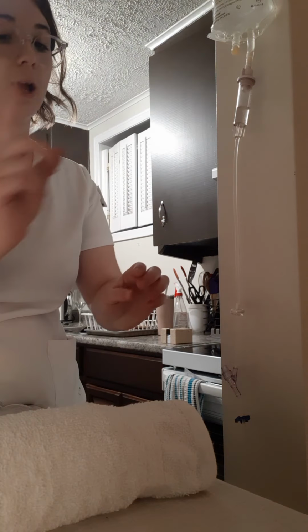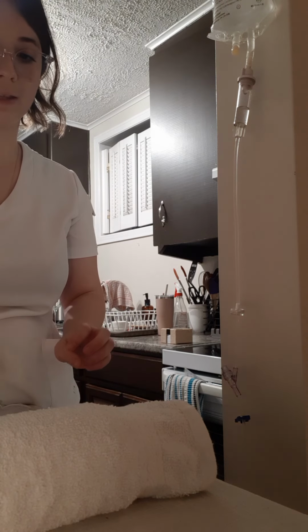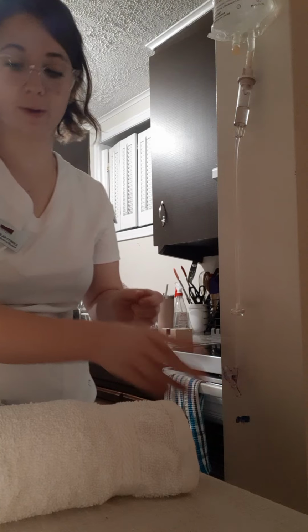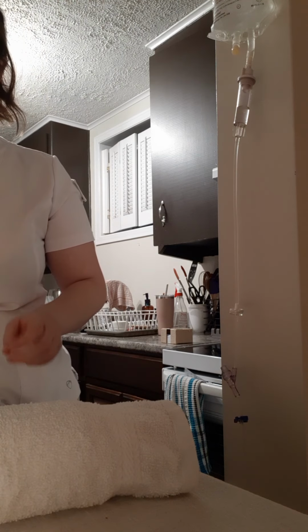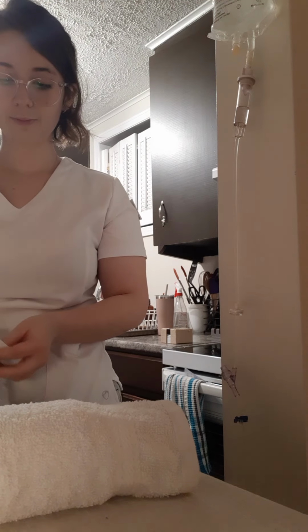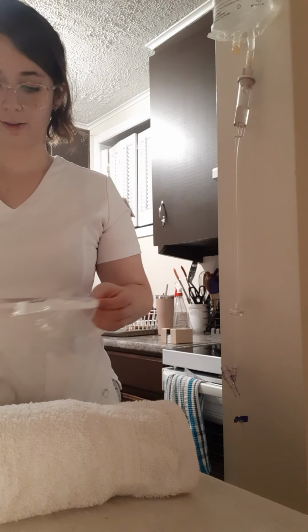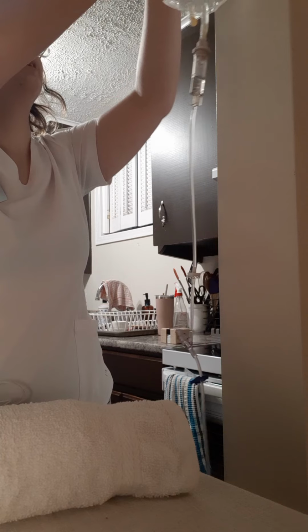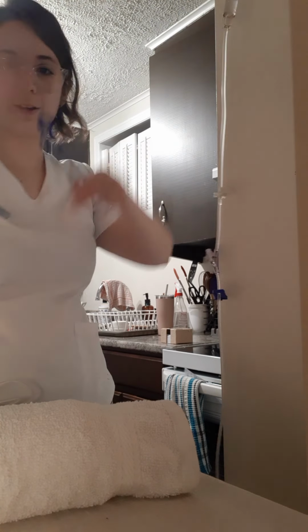Okay, so I'm going to check the site to make sure there's no phlebitis, make sure that the pump is dripping, and make sure that the IV is actually in. Perfect. So before I do anything, I'm going to open my supplies. Oh, this was supposed to be in my bag.